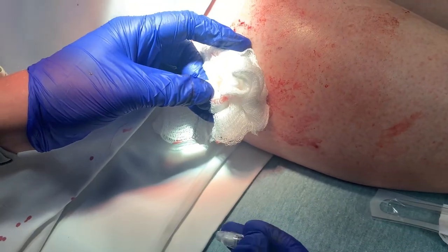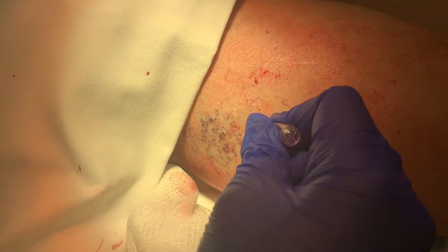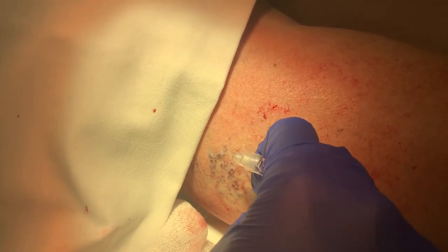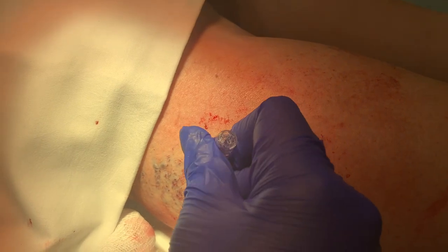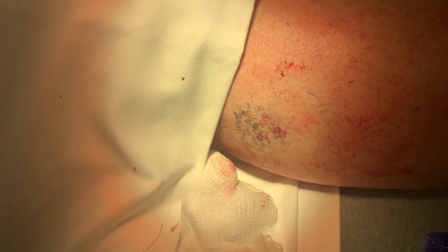We're going to place some Dermabond over this vein. Let's take a look. Look at that. So the trick here is making sure that you don't walk around on this for the rest of today, and that you don't pick at this no matter what. Keep the compression bandage on for the rest of the day. We're just going to let that glue dry.